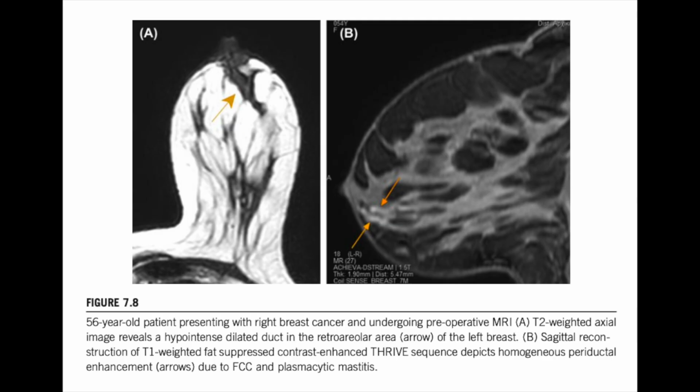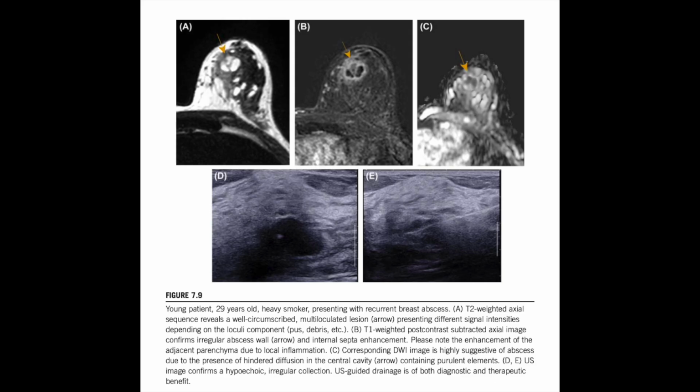What are some of the classic benign conditions that look like cancer? The first major one is adenosis. Pathologically, it's a simple, non-cancerous growth of lobular and stromal tissue, but on an MRI, it can look terrifyingly aggressive. How so? What does it do on the MRI that makes it such a convincing mimic? It often shows up with classic suspicious features. You might see a mass with irregular or even spiculated margins. So the worst kind of margin. The worst kind. Or you'll just see architectural distortion.